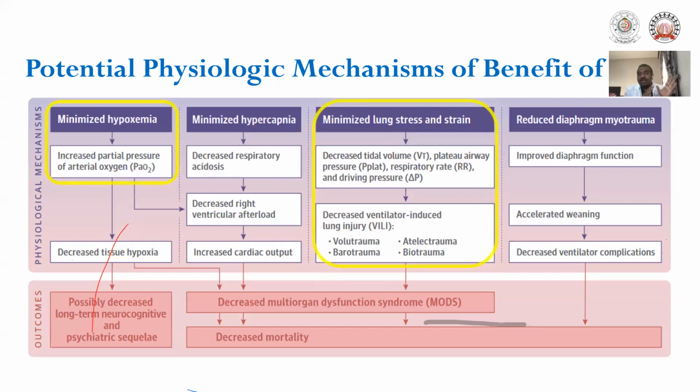But in the past few decades, it has become clear that the major cause of mortality in patients with severe respiratory failure is iatrogenic injury. It is due to ventilator support itself. It's referred to as VILI, ventilator-induced lung injury. ECMO, if we are providing adequate gas exchange, allows the RTs, the respiratory therapists, to decrease the intensity of mechanical ventilation. It will in turn decrease the incidence of VILI.